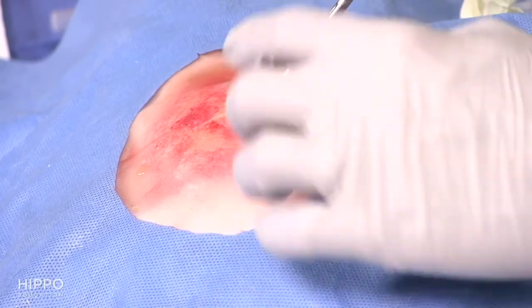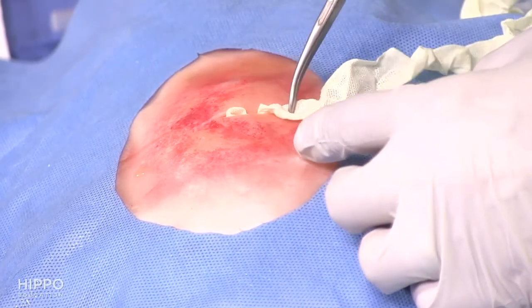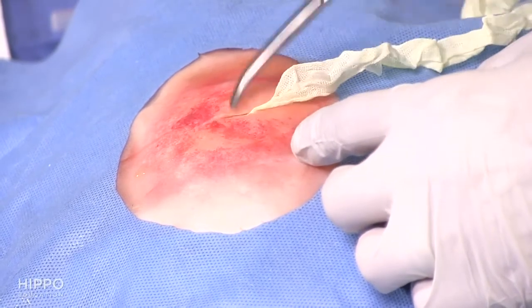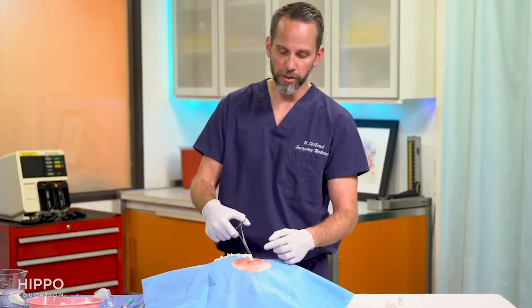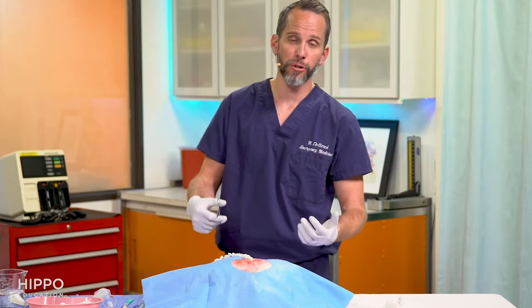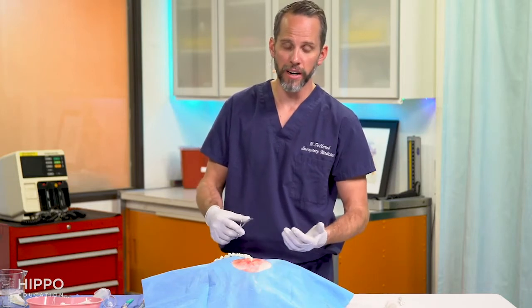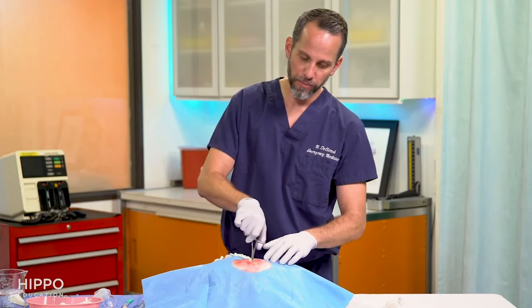Now, if you notice, I've never really ever put my finger in there. People used to say, oh, I'll just blunt dissect with my fingers, or I'll pack with my finger. You don't really want to do that for a couple reasons. A, it's just gross, putting your finger into a pus pocket. And B, if there's any foreign objects, like if this is a shooter's abscess, there's a broken needle in there, any that may puncture you, that's clearly a risk for infectious diseases.